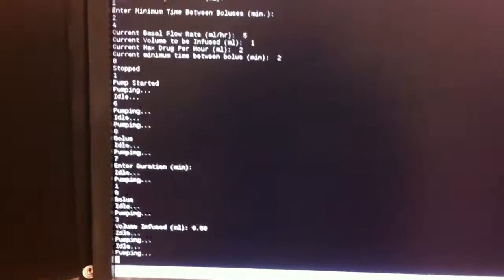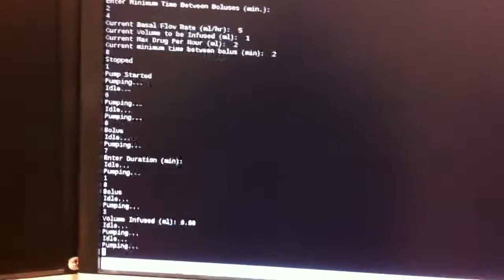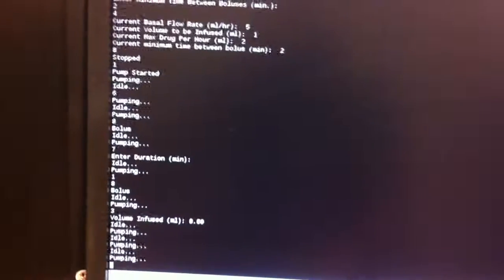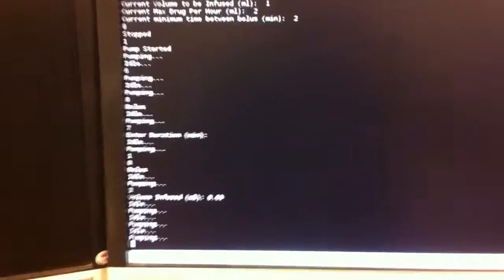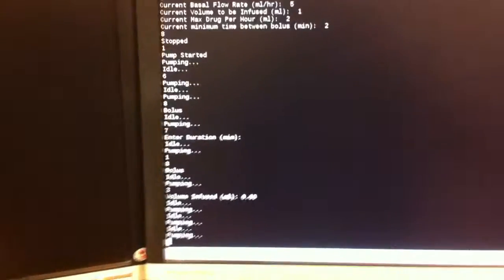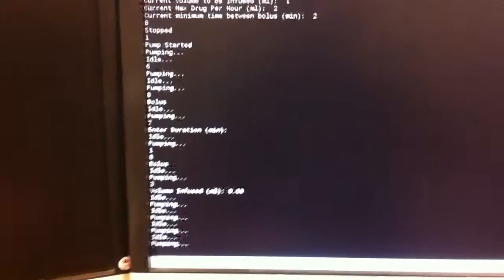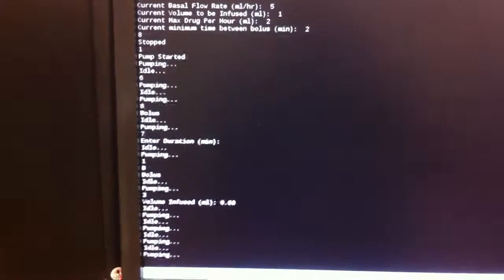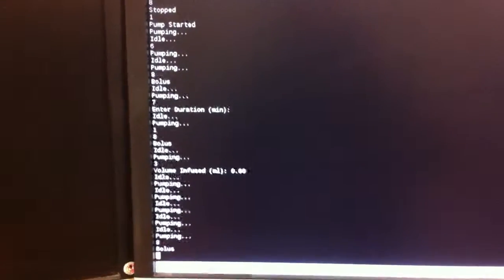So after the patient bolus finishes, we should have dosed something around 1.3 or 1.4 milliliters. And so far there are 6 doses, 6 0.1 milliliter doses dosed during the patient bolus. So we need 5 more, and probably 4 more of basal infusion. So we wait for 14 increments, and then we should be in the clinician bolus mode. Check it's still bolus, so everything is fine.